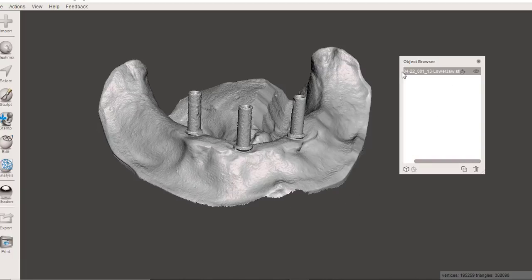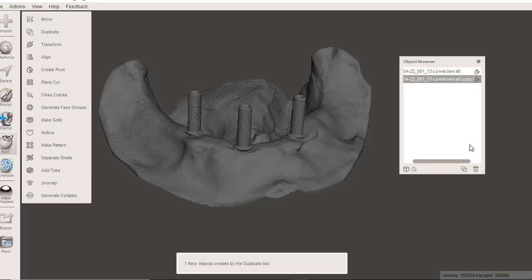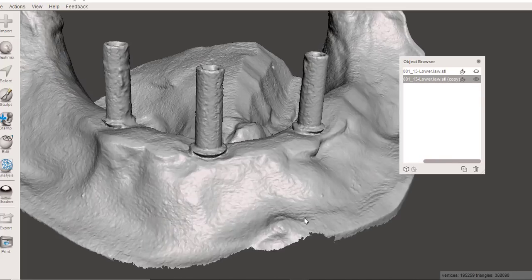Anytime I can eliminate some lab work, I like to. So the first thing I'm going to do is take my STL, and I always duplicate it just so that I've always got one as a baseline that I can come back to. So I'll turn that one off. Actually, let's turn this one on. We'll work off the copy.